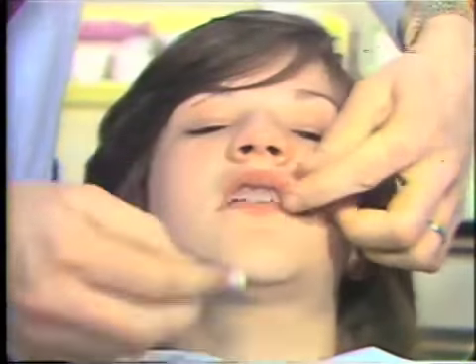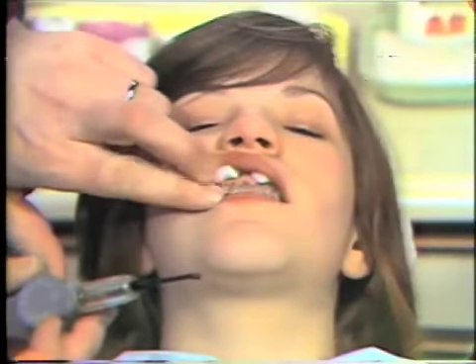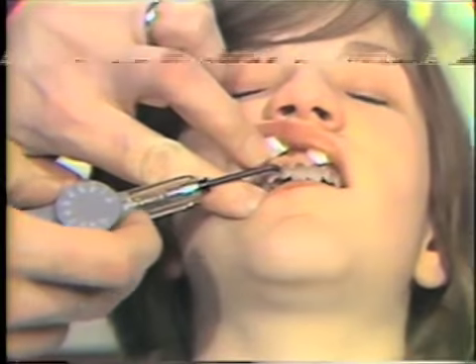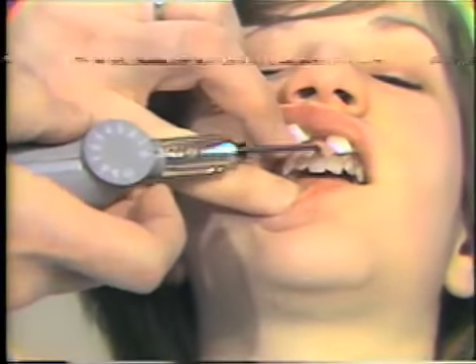And thirdly, during the screening examination, we'd like to check the vitality of these teeth. We'd like to make sure that her teeth are vital and healthy at the start of the procedure. After we've gone through a bleaching sequence, we'll check later to make sure that we didn't produce any irreparable damage to these teeth. Now, Carolyn, we're going to test your teeth with the vitalometer. If you feel something that's discomfort, let us know. Just make a little noise. Okay, number 7's vital.